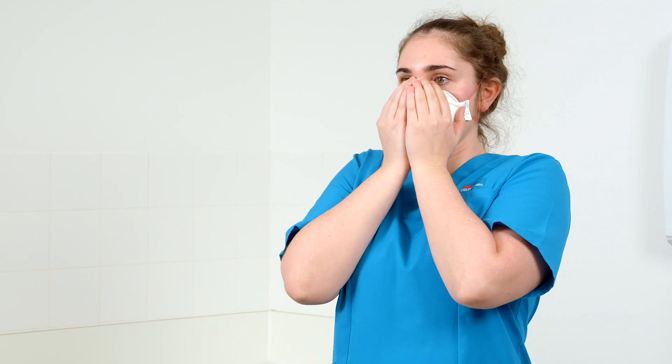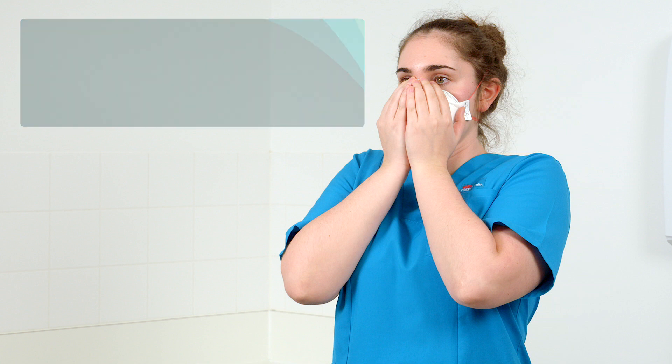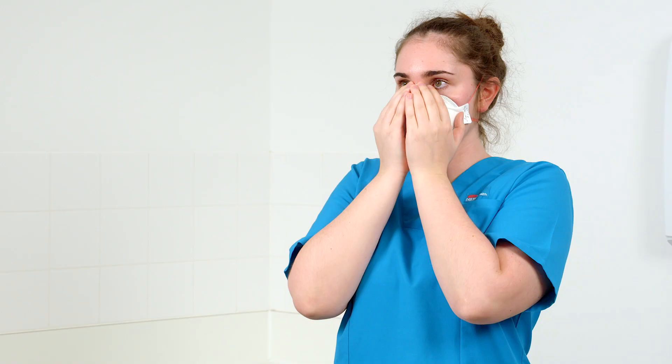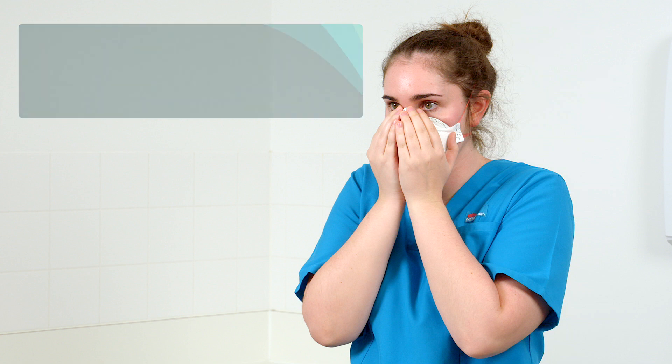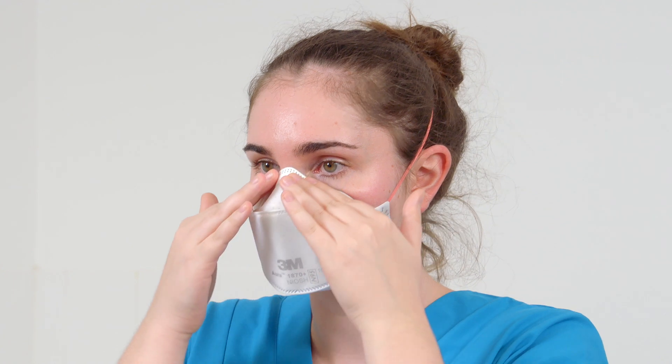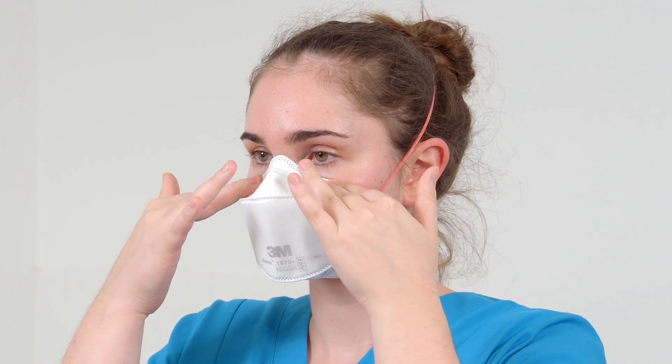Place both hands completely over the middle panel. Cupping the hands, cover the front of the respirator with both hands, being careful not to disturb the fit of the respirator. Inhale and exhale sharply. If you feel air leaks around your nose, readjust the nose piece as described earlier. If air leaks around the respirator edges, adjust the panels and position of straps and make certain the respirator edges fit snugly against the face.